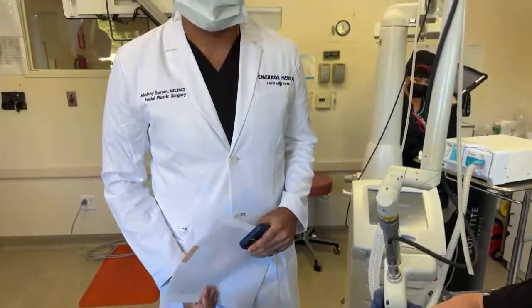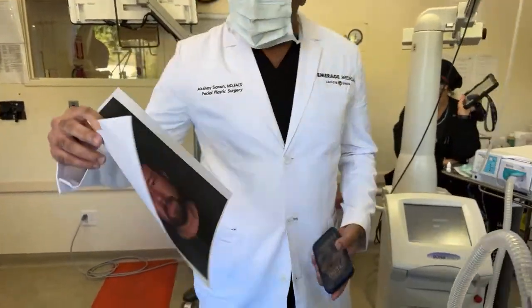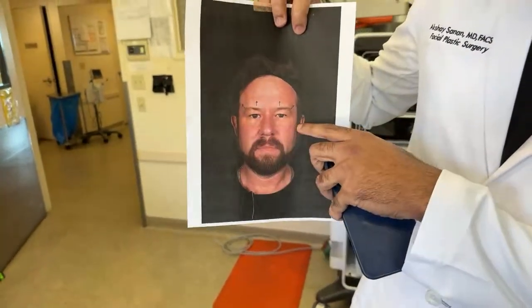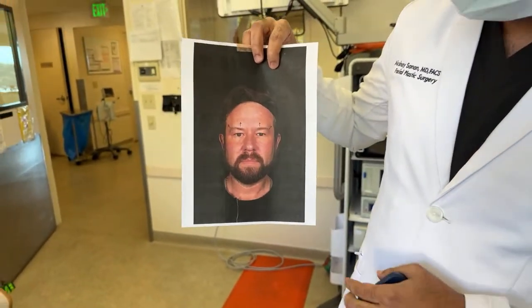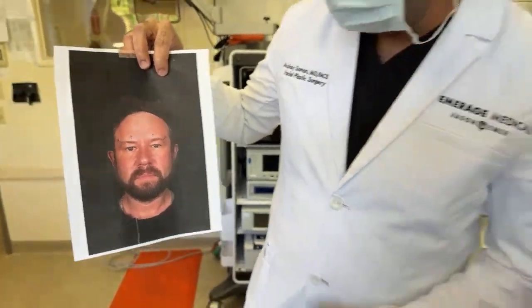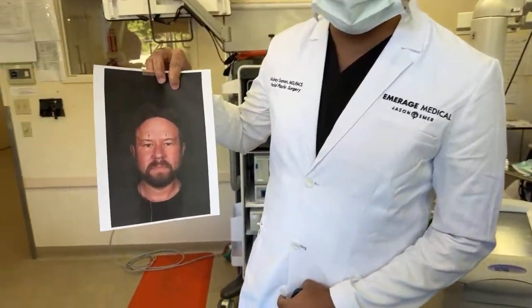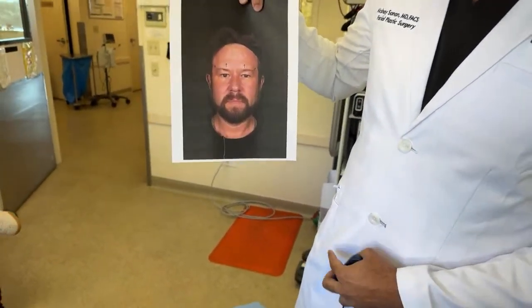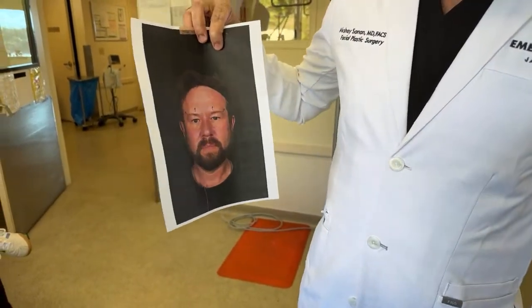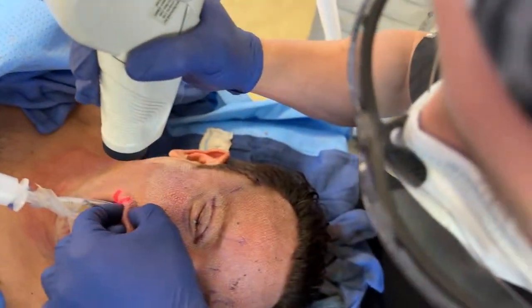Can we talk about his before photo and why he needed it? So this is his before photo. You can see a couple things. I drew the arrows to show the vector that we want to pull the brows in. The central brow is very low. It gives him an angry and tired look. The corner of the brow is also downturned, so that is a sign of aging. So we did incisions on the corners and up in the hairline. It's as scarless and incisionless as possible.